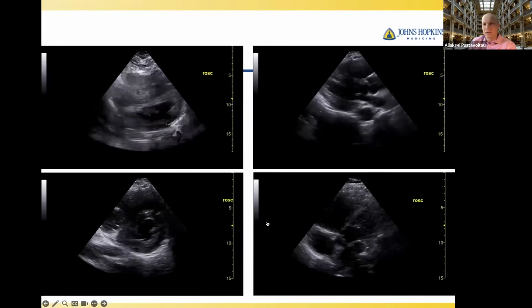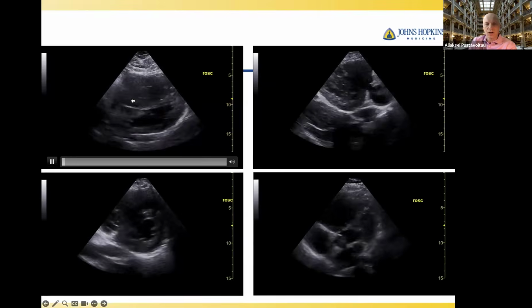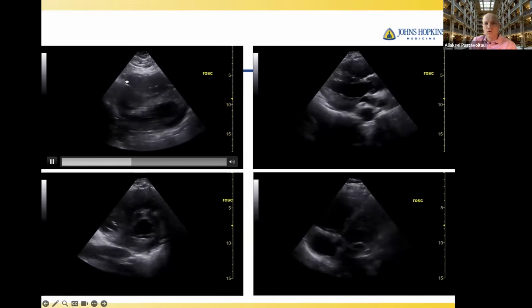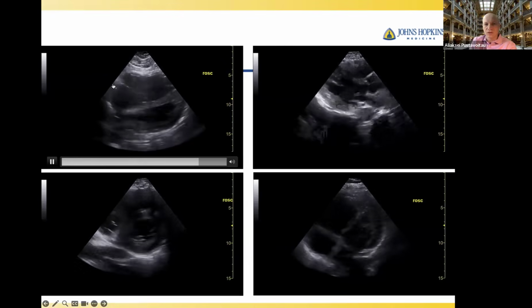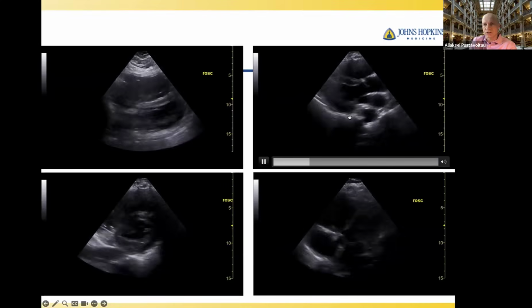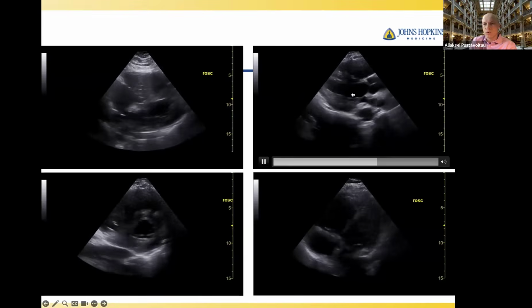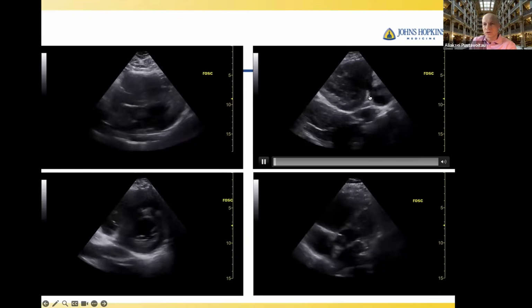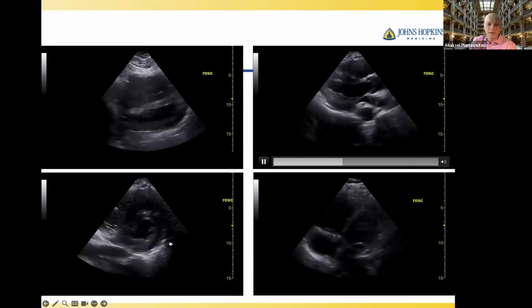So now we can complete the full evaluation of the patient. Starting with the subcostal view, again, the right-sided chamber looks like it's moving better. And the tricuspid valve here, which is a measure of right ventricular activity, actually moves better horizontally. This is the parasternal long axis view, which reflects the same thing. In the left-sided chamber, we see more blood being delivered to the left side. The right side moves better. This is the descending aorta. This is the left atrium. That's the aortic valve here, the mitral valve here. So the blood flows on the left side.